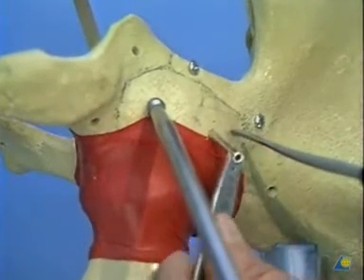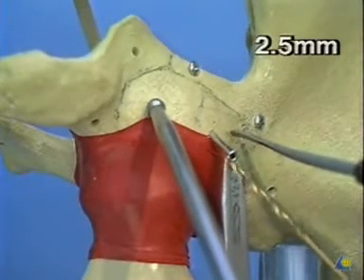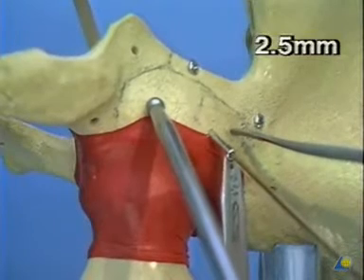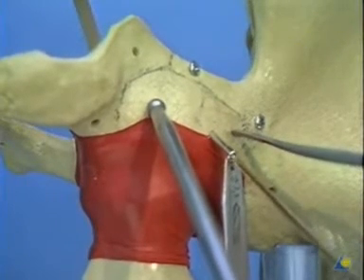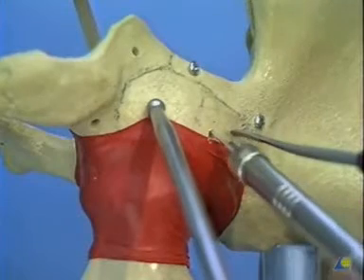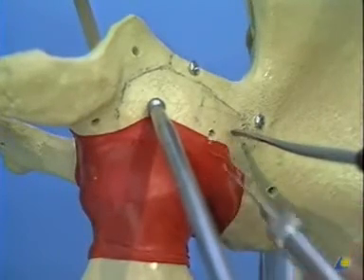With the patient in a prone position, a horizontal orientation of the drill bit will direct the drill clear of the joint. The depth is measured and the screw inserted. Repeat this procedure for the second screw.